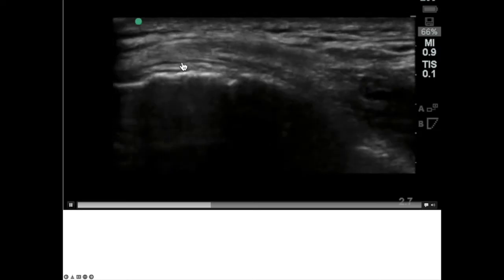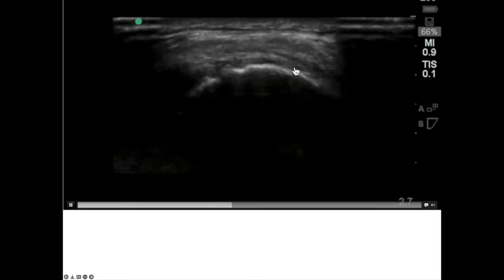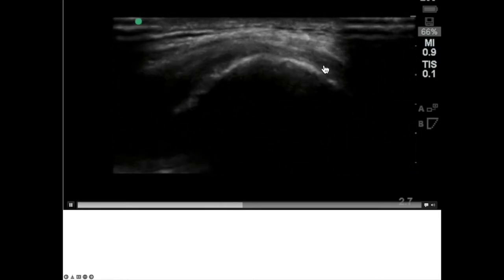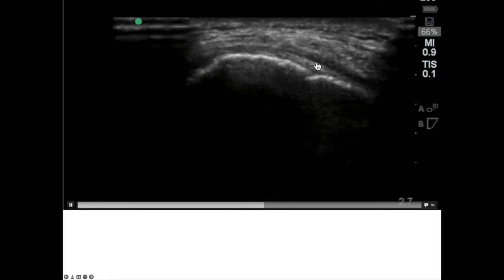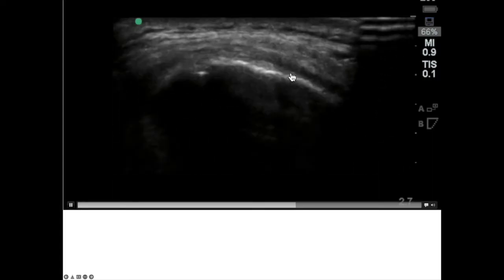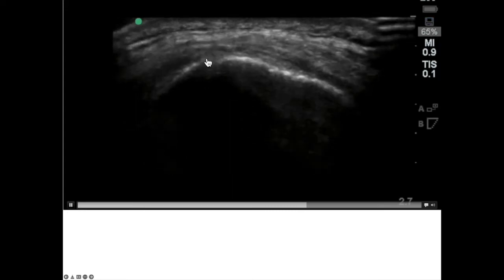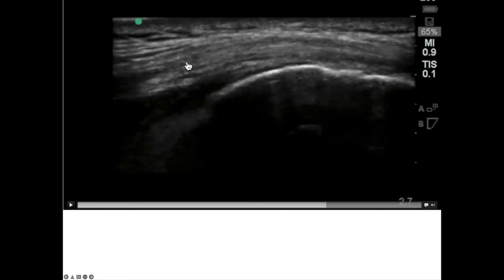be. Sometimes you may not see this fairly well, and you just continue the tilting, and here you go. And tilting, you can see it really well. Or there's another method you can do, which is the long axis scan. It means you align the probe along the long axis of the gluteus medius tendon, and here it is. So beautiful. So again, it's the same fascia lata.